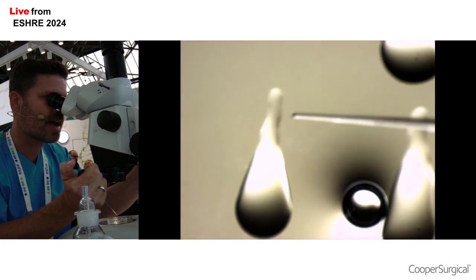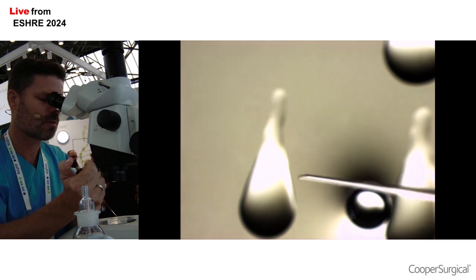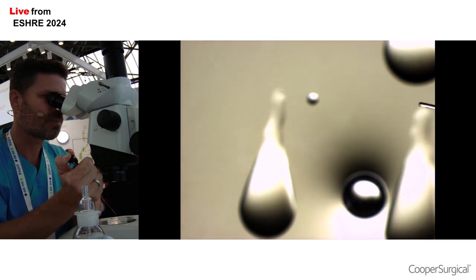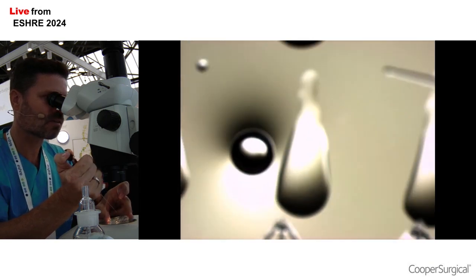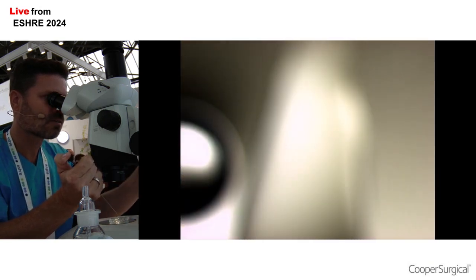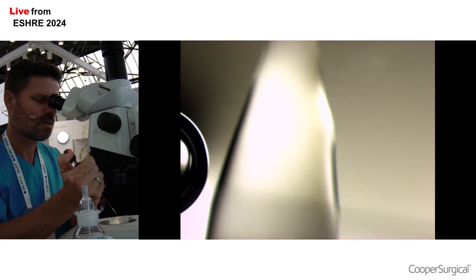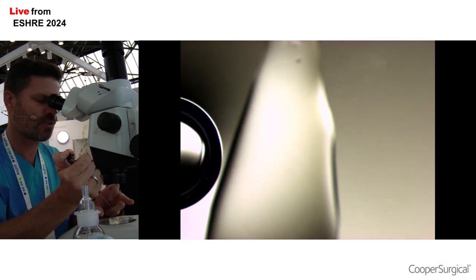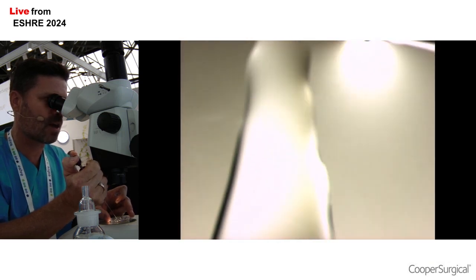So I'm just doing this by eye using the stereo microscope. I place a very small amount there, a little bit more in the second drop, and in the third drop I'll put quite a lot.